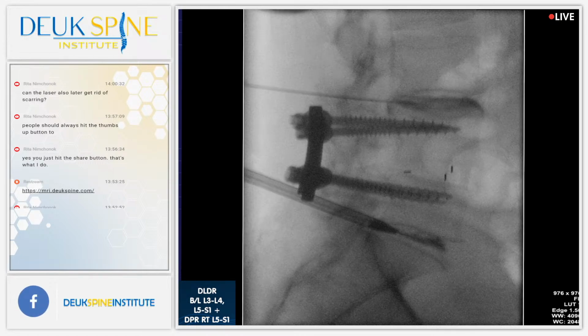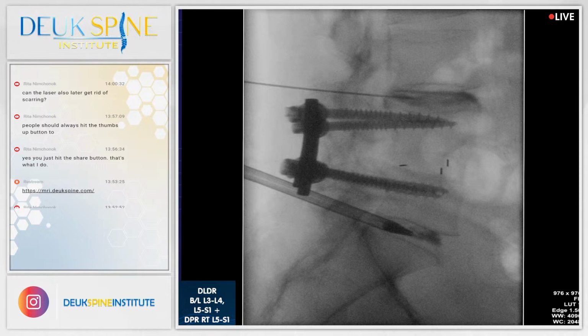Hold on. Yeah, okay, good. All right. Remember, we didn't have a lot of room here, but we got in. And I'm glad we did, because this disc is a 10 out of 10. I mean, sorry, was it 10 or 8? 10. 10 out of 10 in pain.